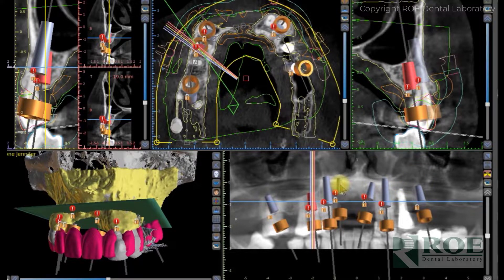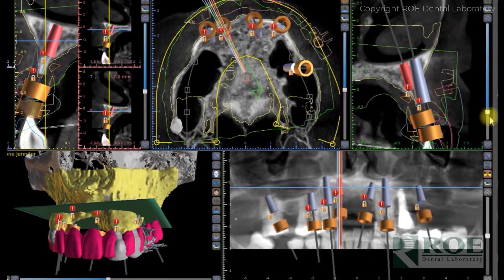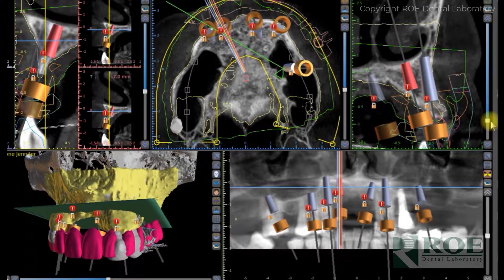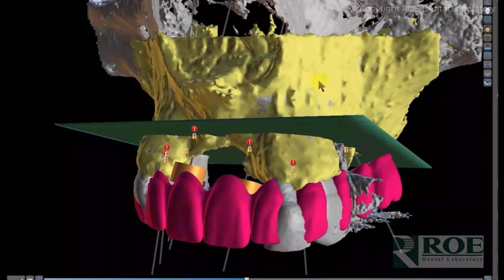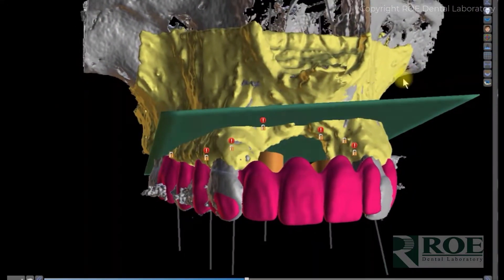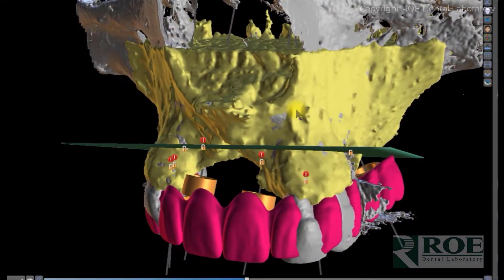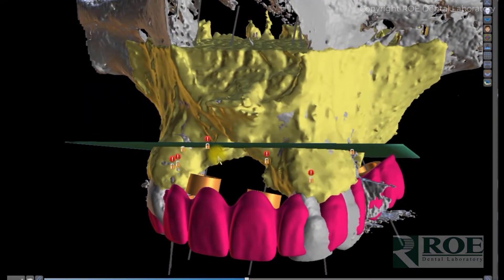This patient has, as mentioned, a bony defect in the anterior, so there were some smaller implants placed up in the pre-maxilla. We go through the entire case to make sure the bone reduction is accepted and the teeth are in the correct position as the doctor wants.